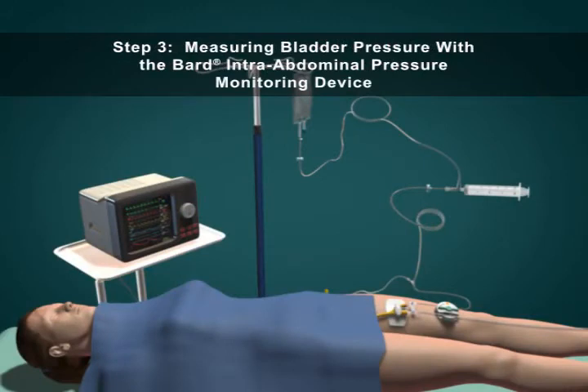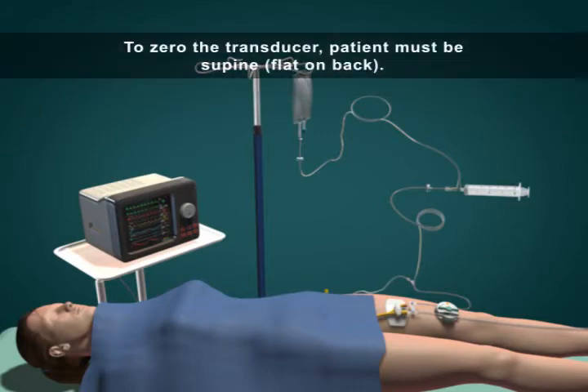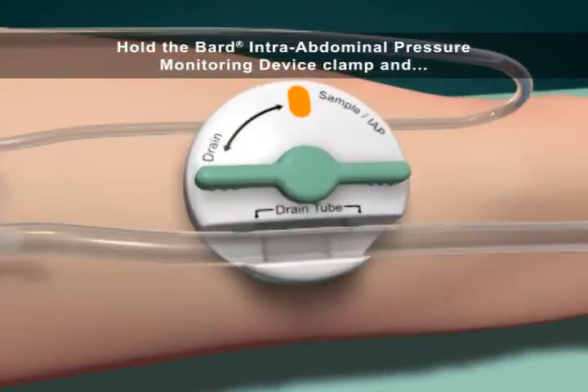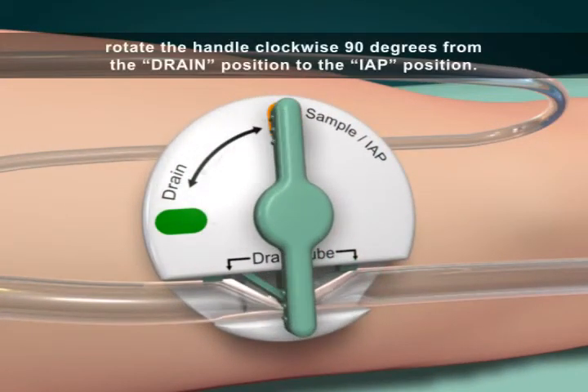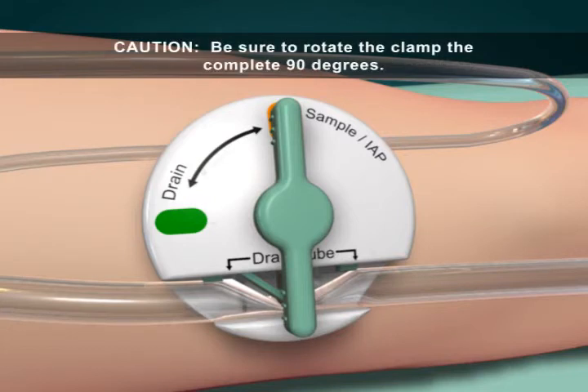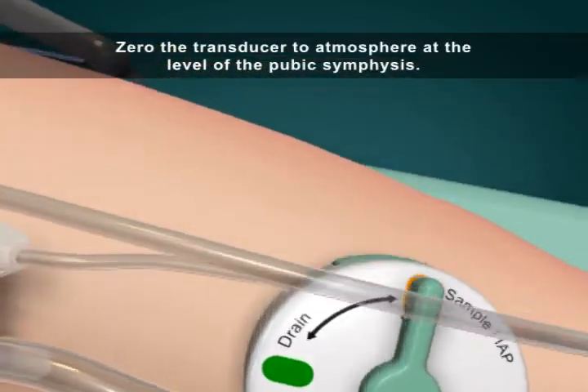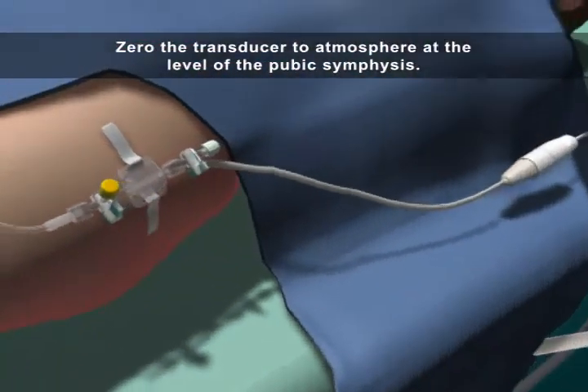Step 3: Measuring bladder pressure with the Bard intra-abdominal pressure monitoring device. To zero the transducer, the patient must be supine. Hold the Bard intra-abdominal pressure monitoring device clamp and rotate the handle clockwise 90 degrees from the drain position to the IAP position. Caution: be sure to rotate the clamp the complete 90 degrees. Verify the drain tube is completely kinked by the clamp. Zero the transducer to atmosphere at the level of the pubic symphysis.